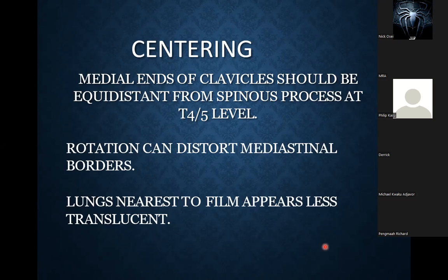As I'm saying, if the person is rotated either a bit to the left or to the right, the part of the body that is closer to the film will appear more opaque. That is, the part that is closest will appear less translucent. That means it will be more opaque and appear as if there's consolidation at that point. Meanwhile, it is just positioned poorly on the film.